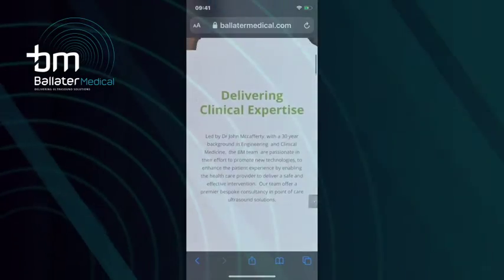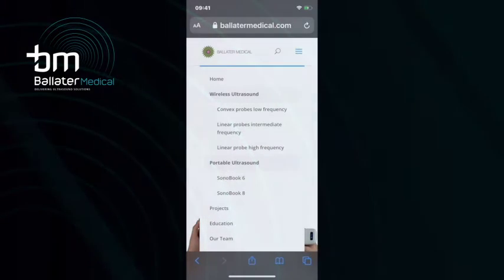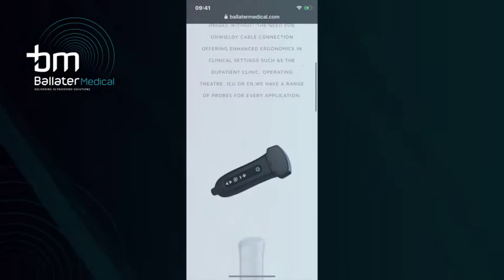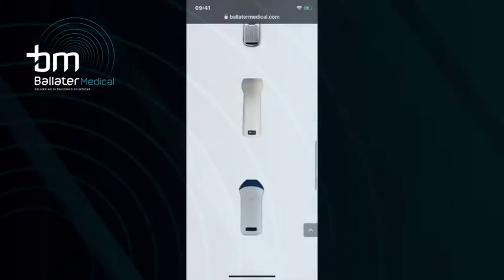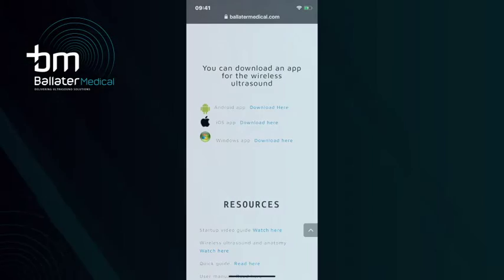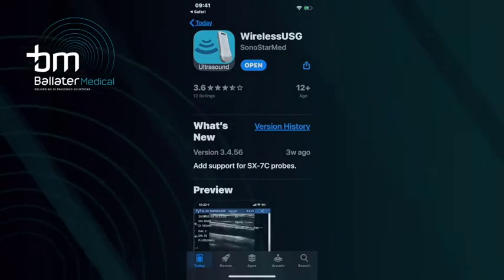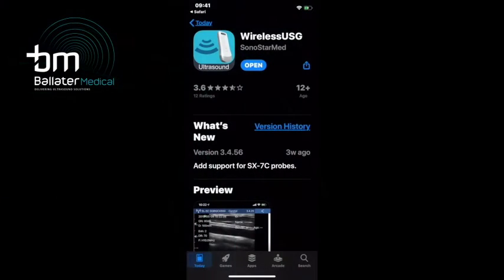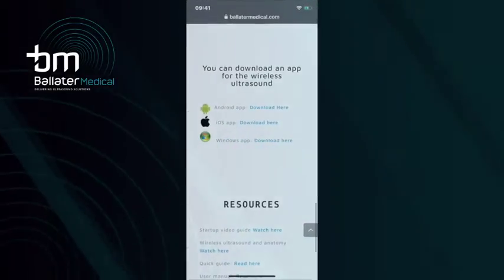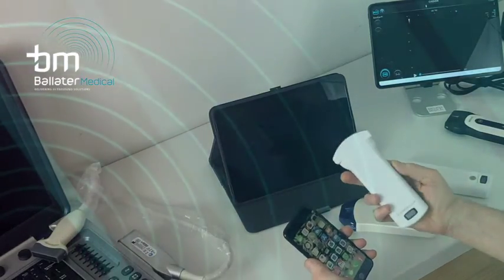So the first step in setting up your virtual ultrasound class is to connect your wireless ultrasound probe to your iPhone. For this you need to download an app from the App Store. So go to Medical website, wireless ultrasound page, scroll down to utilities including a link to the App Store where you can download the relevant application that will allow you to connect. Wireless USG is the name of the application. Download the application, and you are ready now to connect your wireless device with your phone.